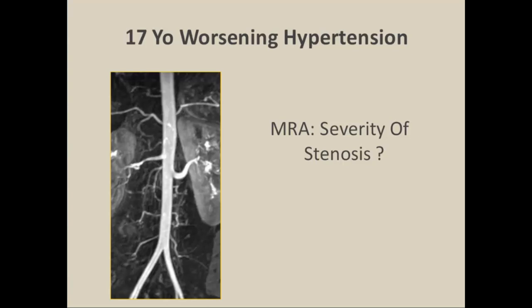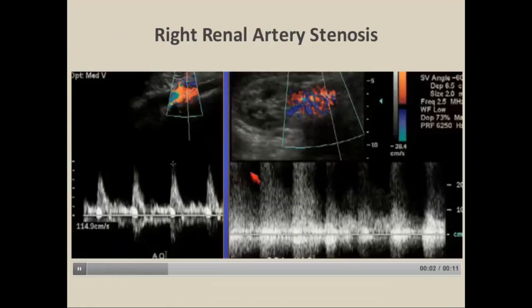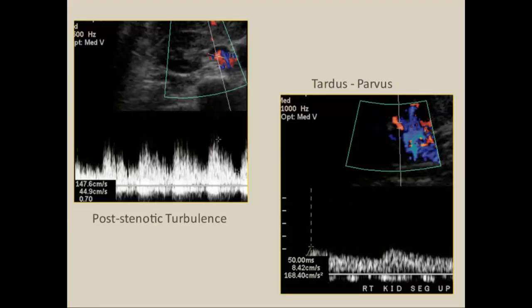Here was a 17-year-old who presented with worsening hypertension, initially worked up with magnetic resonance angiography. Before sending this patient to invasive treatment, we wanted to confirm hemodynamic significance. The Doppler study showed elevated velocities off the scale — aliasing over 300 cm/s — a color bruit artifact overlying the vessel, post-stenotic turbulence as another sign of hemodynamic significance, and tardus-parvus waveforms. Everything confirmed this was indeed a tight stenosis justifying treatment.